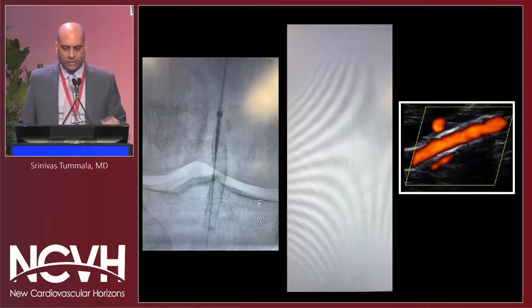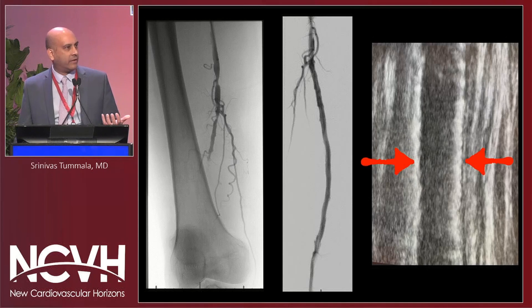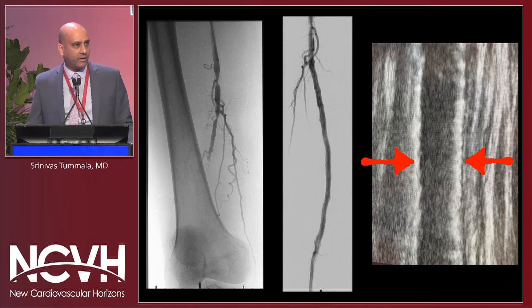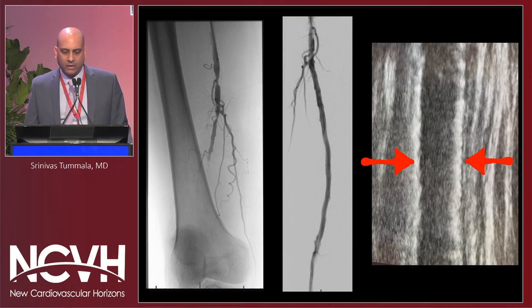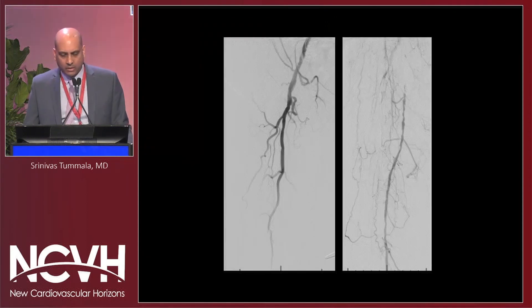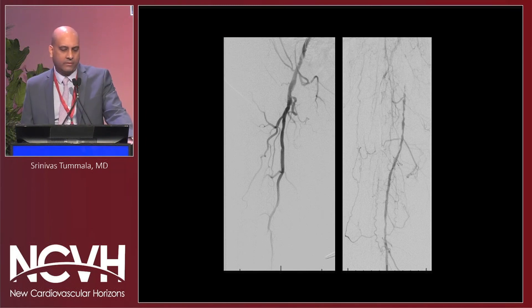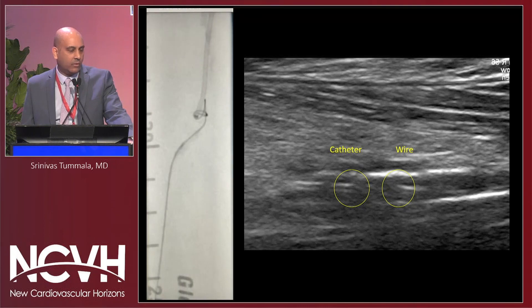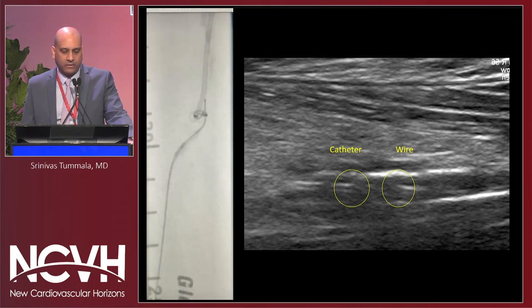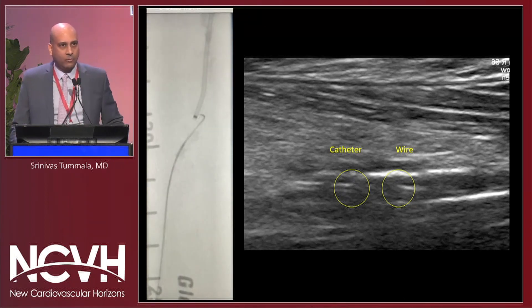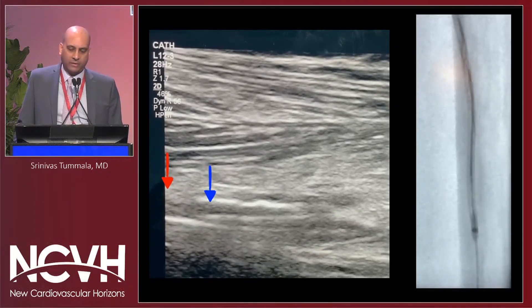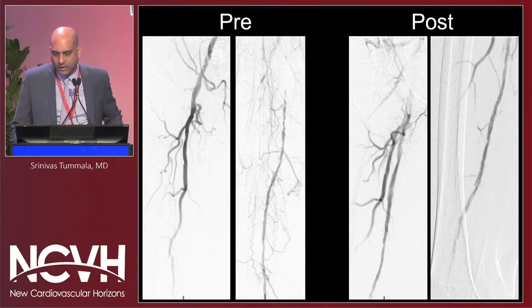IVUS could work here as well. Here's another case showing that extravascular ultrasound can help you with stent malposition — or when you don't have good dilation or proper sizing. Look at the wall apposition when viewing the stent with extravascular ultrasound, telling me I have a good lumen. Another patient with a flush occlusion in the SFA reconstituting the distal SFA — we have access from above and below, clearly in two different sub-intimal planes trying to get them to meet. Using different wires, heavier tip loads, and shaping them is one option. But we used ultrasound and were able to see where the two systems were, get through-and-through access pretty easily using ultrasound guidance, and then deliver therapy.